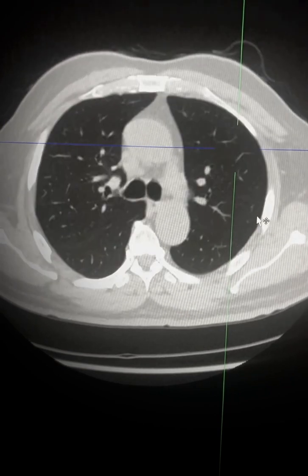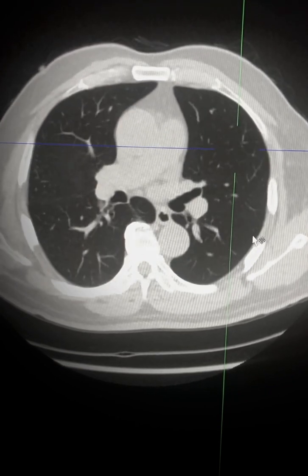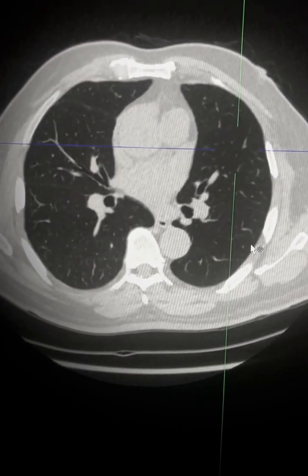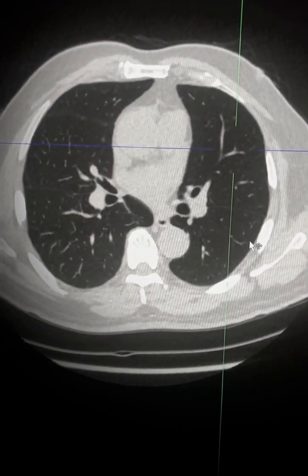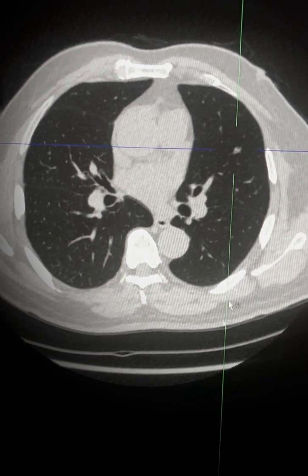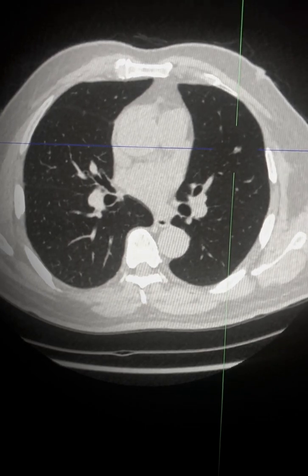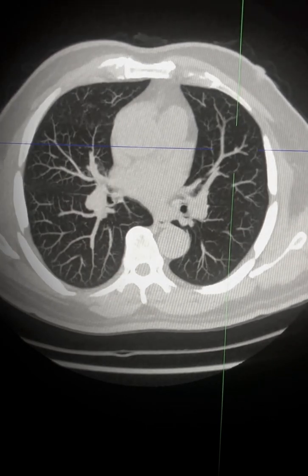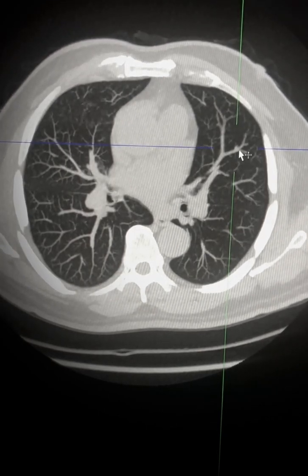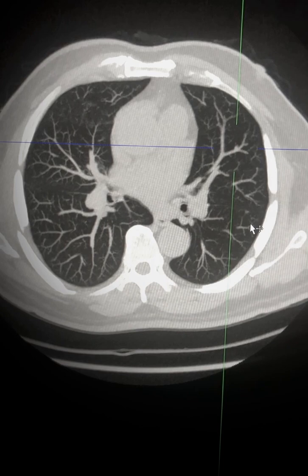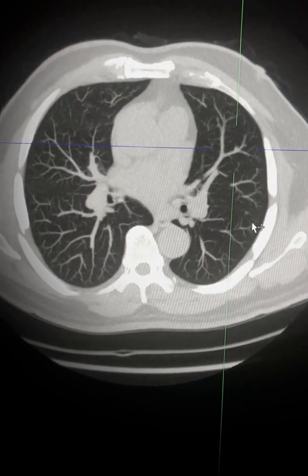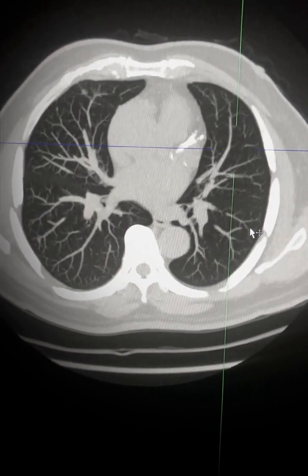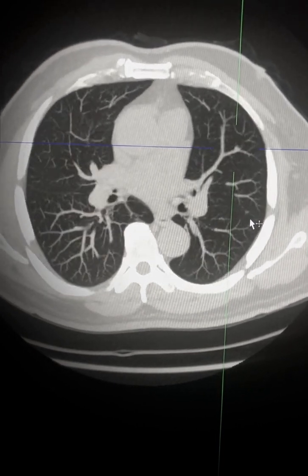The next feature is to use a slightly increased maximal intensity projection. You can see that this small nodule becomes much more conspicuous and stays on the scroll for a bit longer.